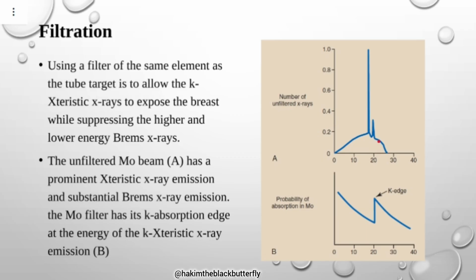However, compression achieves a near uniform thickness of the breast. When this breast is compressed, almost the whole breast becomes of a uniform thickness. But of course, the breast cannot become as thin as the nipple. Again, when you look at the top of the breast, the nipple is still conic there.